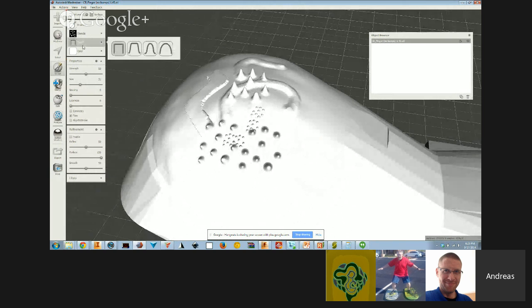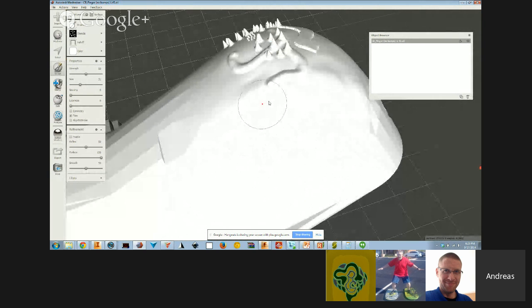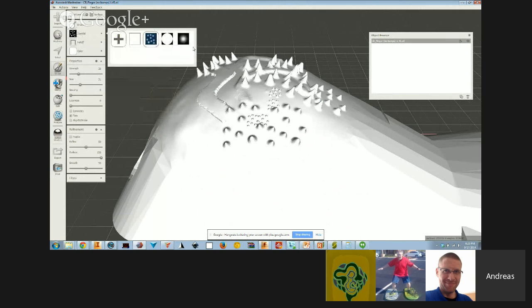So in theory, you could do some kind of pattern that would be similar to a fingerprint. You could. Yeah, definitely. I mean, people have done all kinds of different things to make it so that the fingers are able to grip things better. So this is good for more of that. Definitely, and if I decrease the strength, I'm not going to get these tall ones as tall, right? And of course, a different stencil will give me different results.